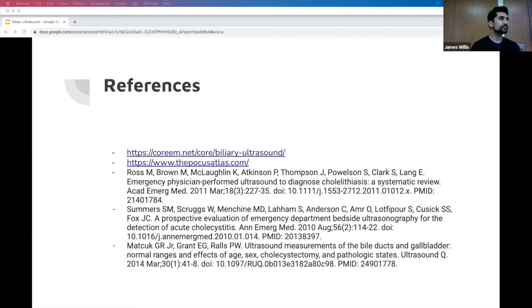I really like how you highlighted the positive value. One thing I really push is that physicians who are afraid to do their own ultrasound focus on a small part and aren't good at it, because they're going to get judged on one aspect of it. I'd be happy to forget the CBD, as long as instead they focus on what they see.